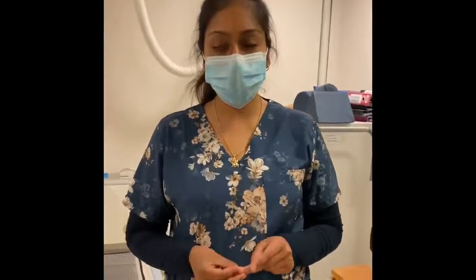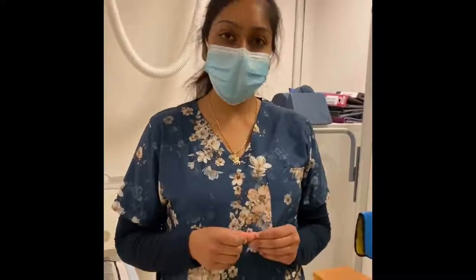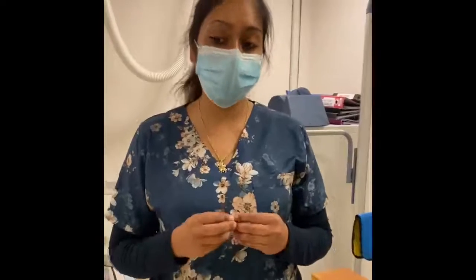So moving on to your orbits, your routine projections are your parietoacanthial view, or your Waters method, which we have discussed previously, as well as a parieto-orbital oblique view. Now this view, you really need to get it. It is a bit difficult. If you are not completely happy with your understanding of how to position, please refer to your Bontrager book to get more information, as well as your notes.